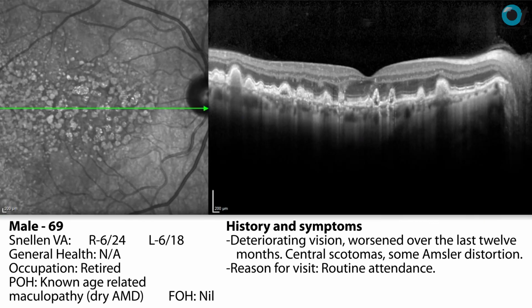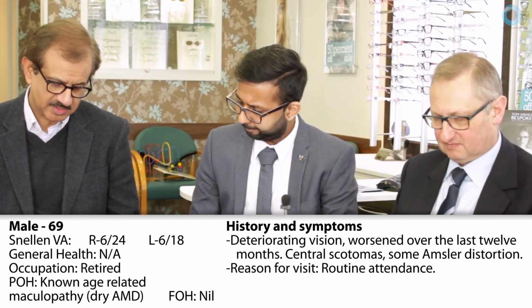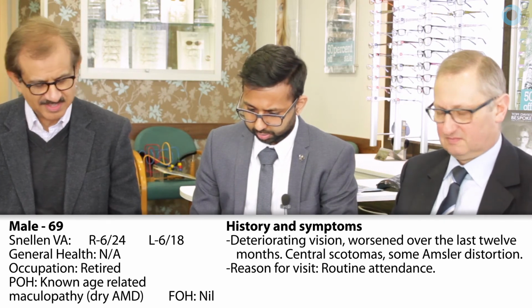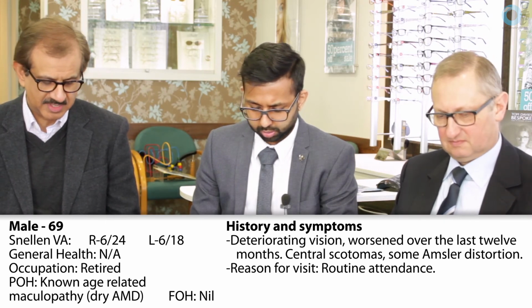Some extensive focal disruption to the RPE. Perhaps that's just the reflection of the drusen that's causing that, extensive drusen that you can see. A few things come to mind. First of all, he's obviously got dry macular degeneration. He's relatively young for this quantity, and I wonder if there's a familial element or a lifestyle element as well.